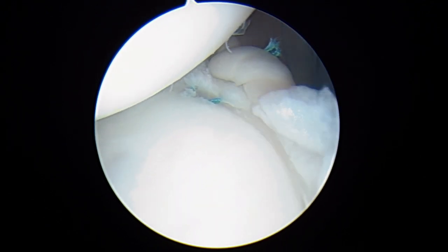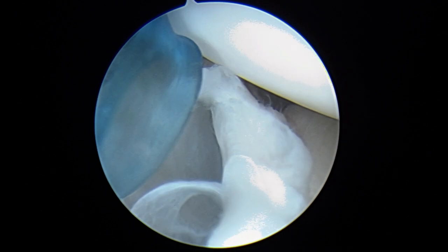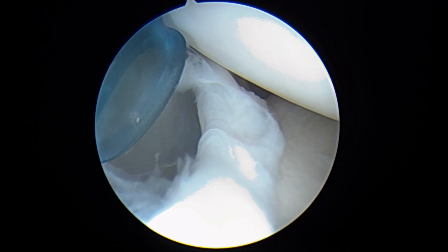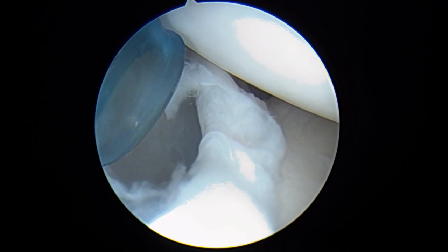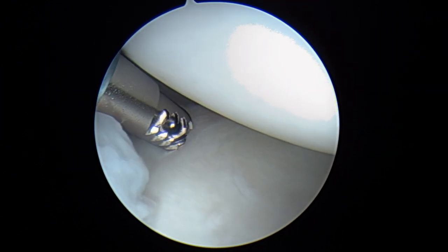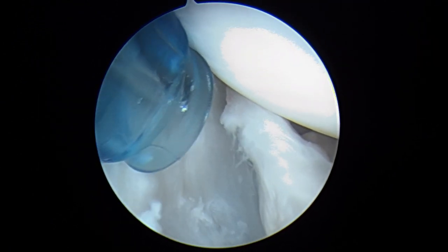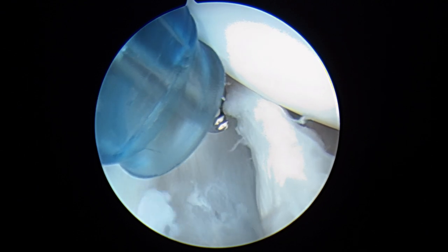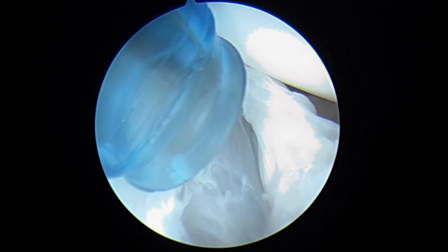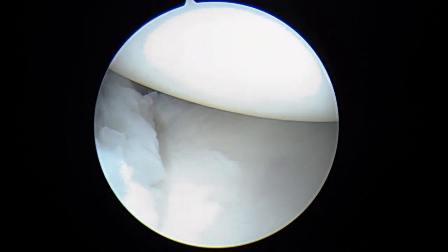Now we're going to turn our attention towards the front of the shoulder. We're going to be placing an anchor right about here, which is going to allow us to tighten this anterior band of the inferior glenohumeral ligament. You can see you have a band — sometimes we look in and there isn't one at all, but yours is still there, it just hasn't been sufficient, and so we're going to tighten it. We'll go ahead and take our guide and show you more in just a minute.